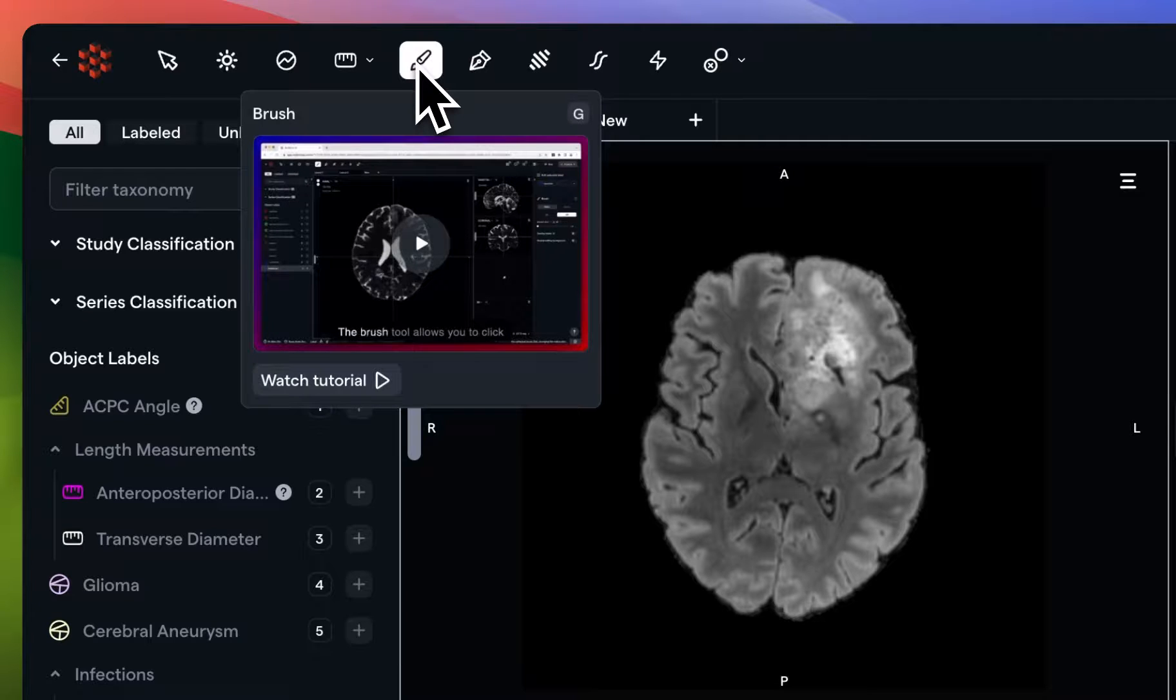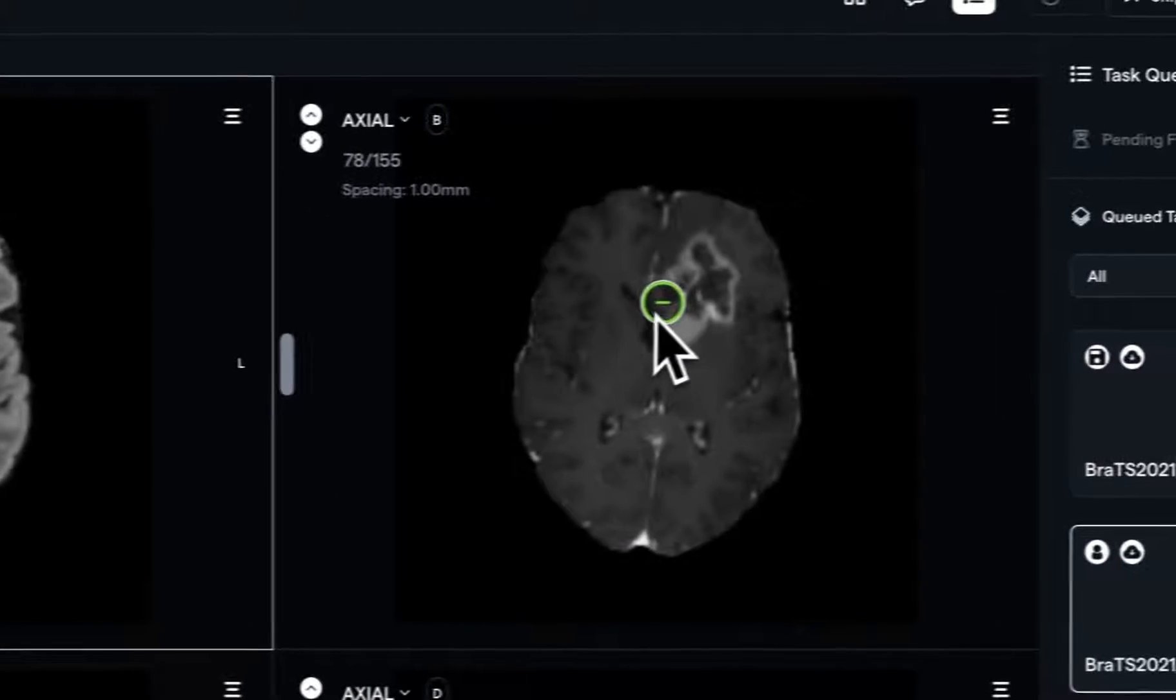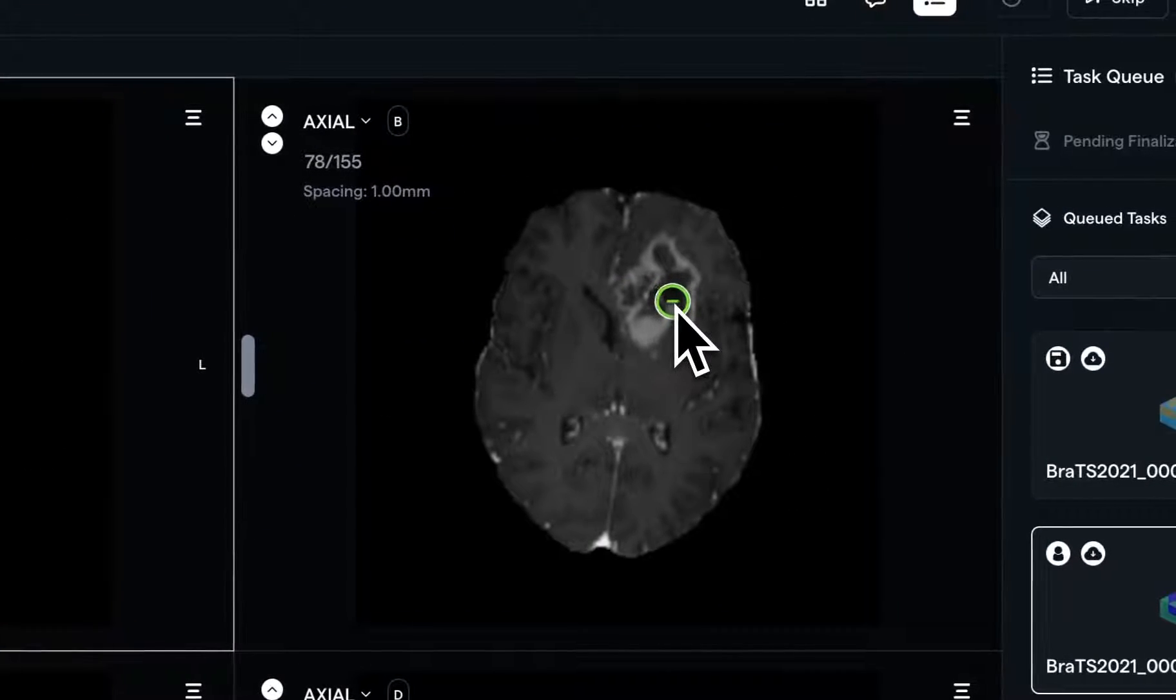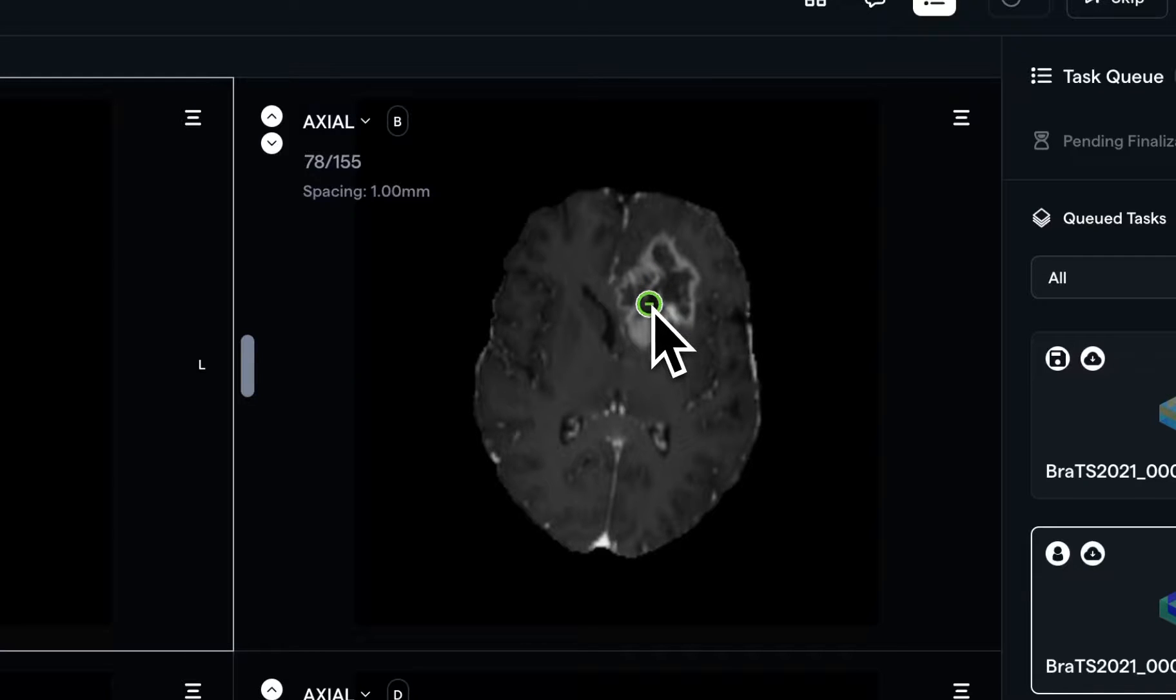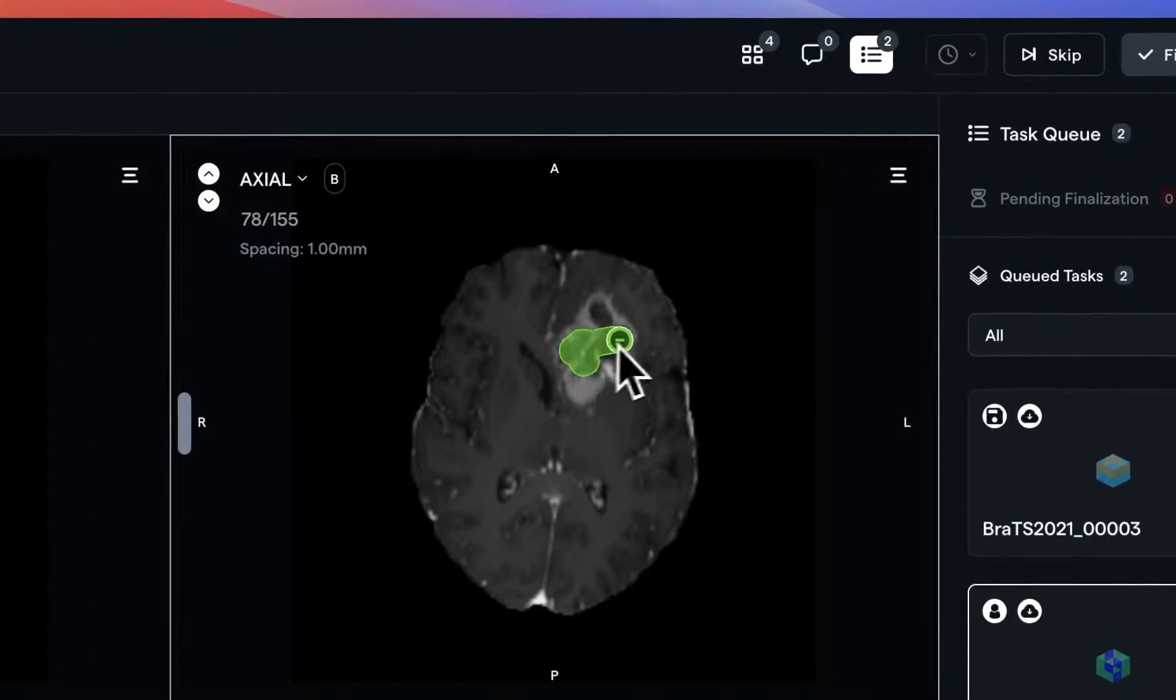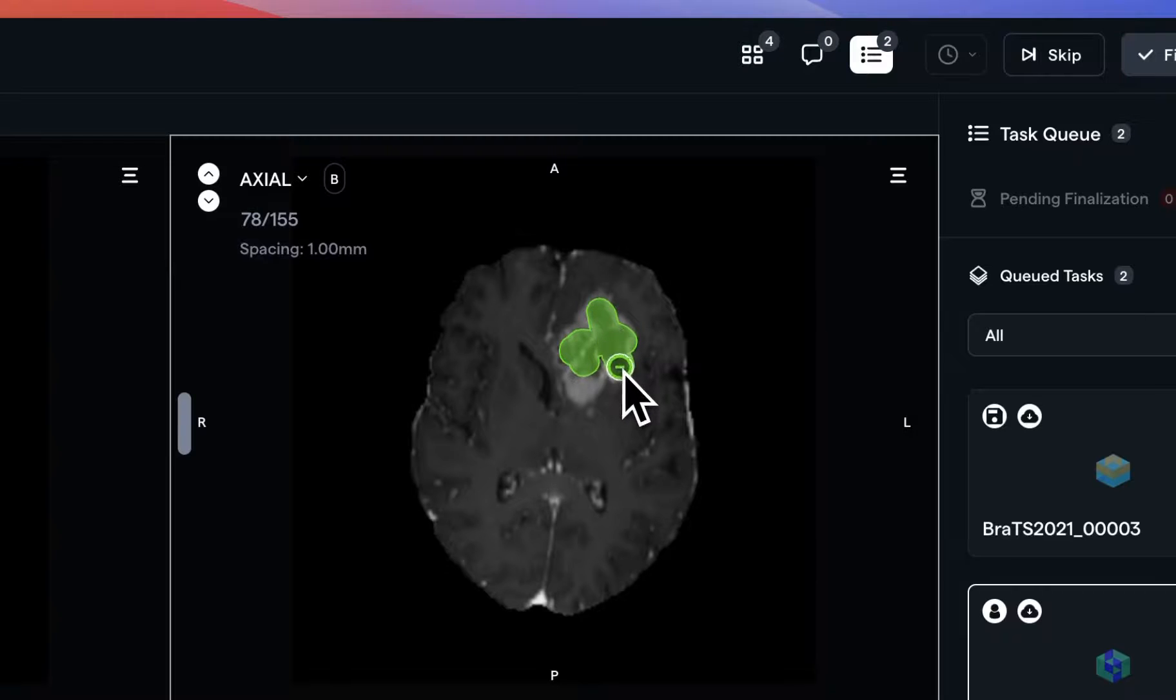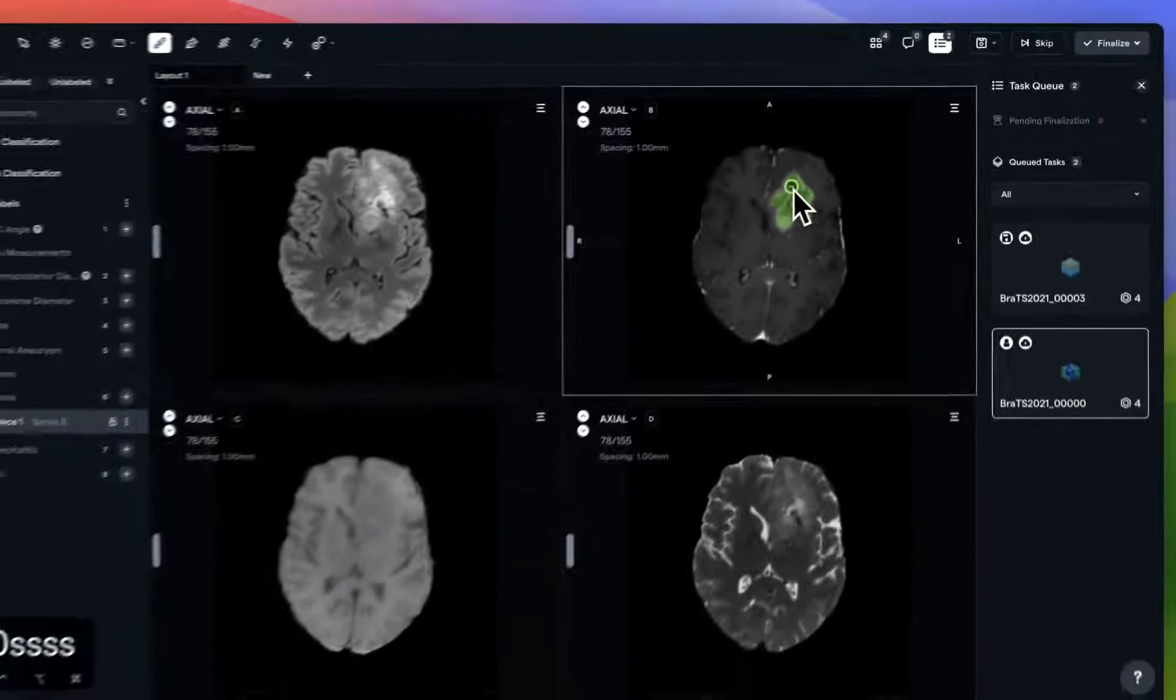With my brush tool selected, I'm going to move over to Series B, use a hotkey to make my brush tool smaller, and left-click to draw. We have an approximation of a segmentation here.